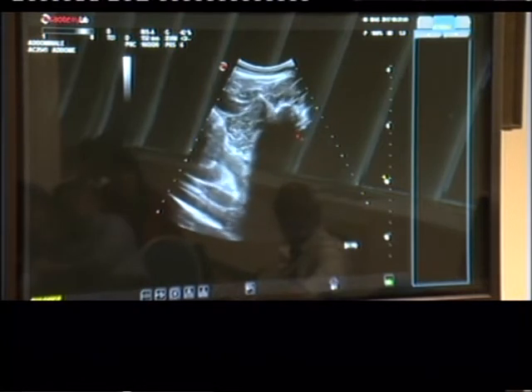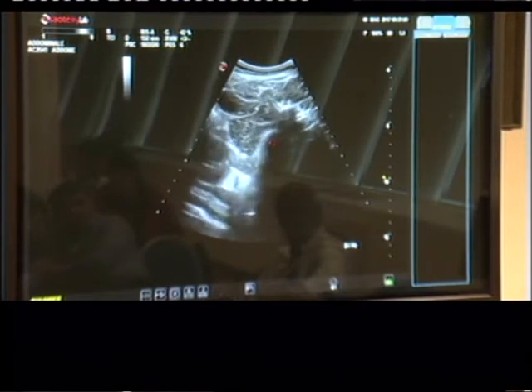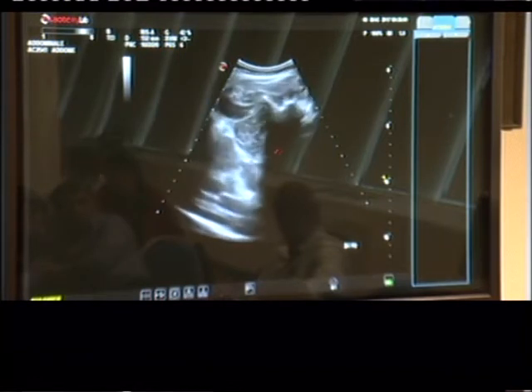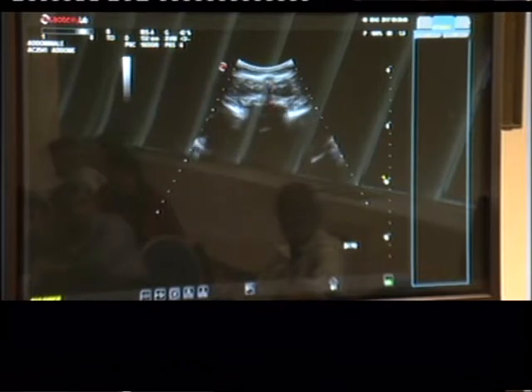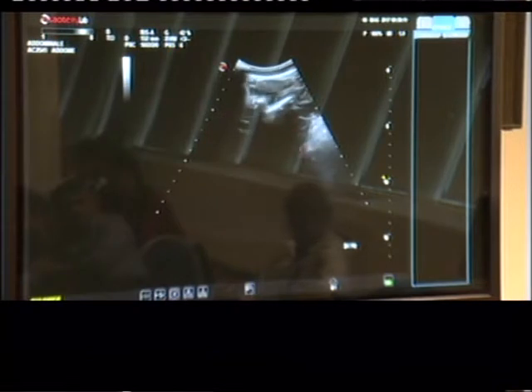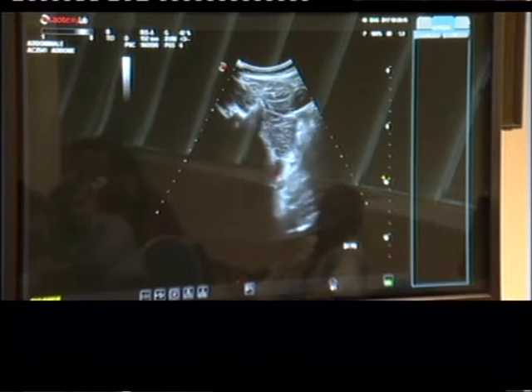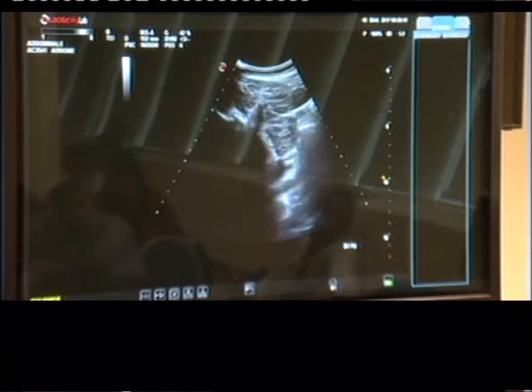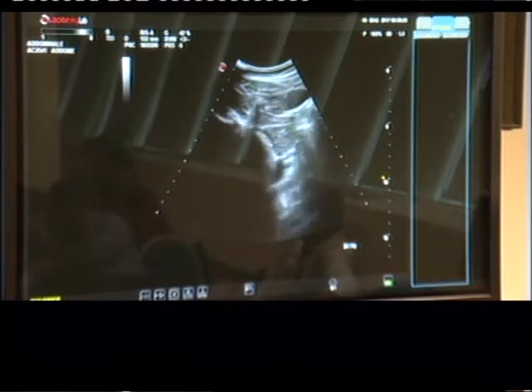Then you can see this is that W, and then the spinal canal here. So now what I'm going to do is I'm going to go back. So spinous process, facet, transverse process, quadratus lumborum, psoas, body of vertebra, sympathetic chain, vena cava. Same thing on the other side.